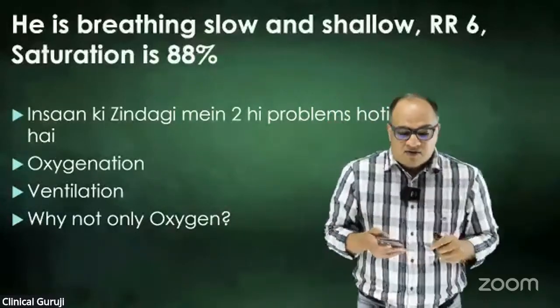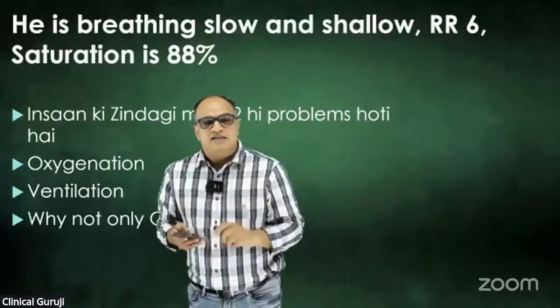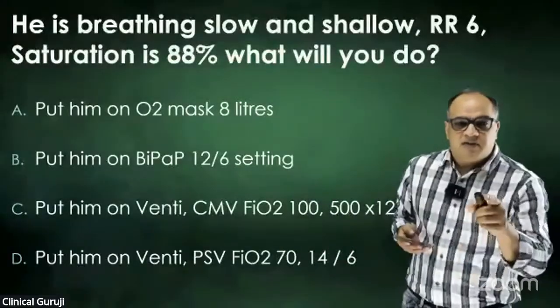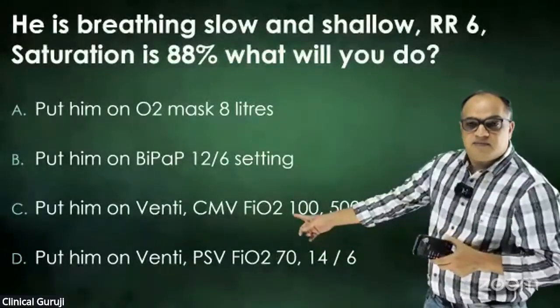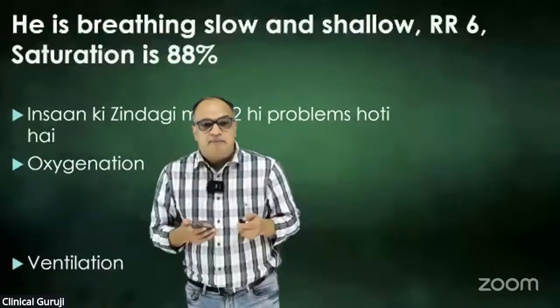Right, fair enough. Why not BiPAP? Somebody wrote BiPAP. Why not BiPAP? My answer for this question will be C, CMV. So why not PSV? Why not BiPAP?